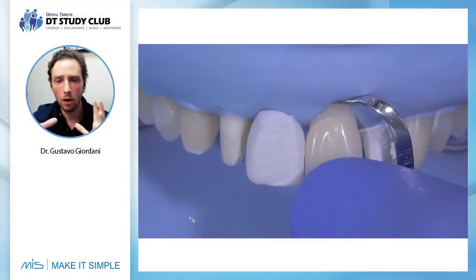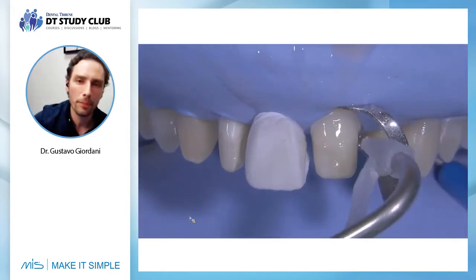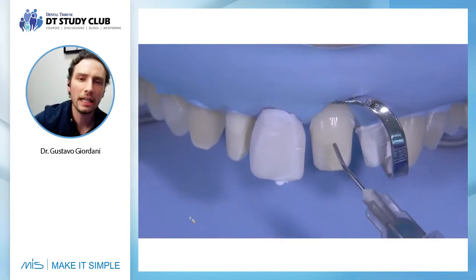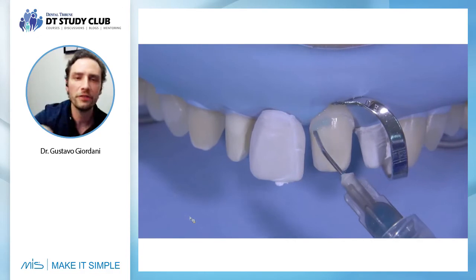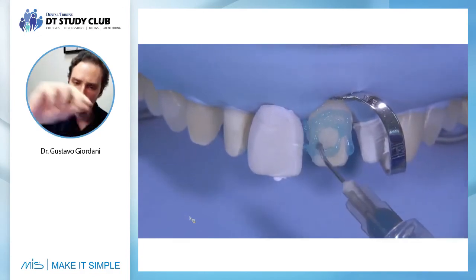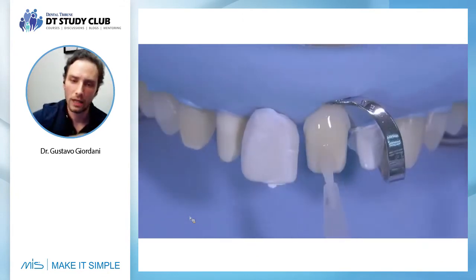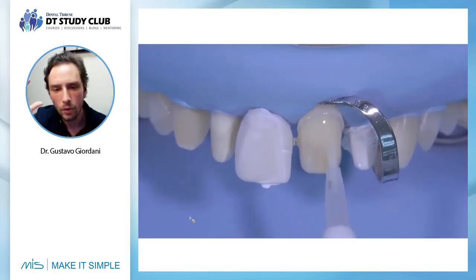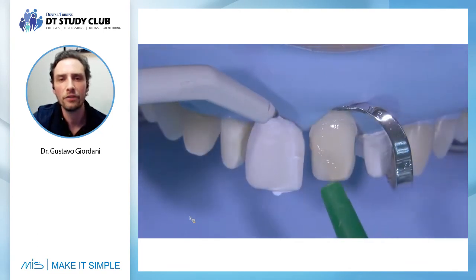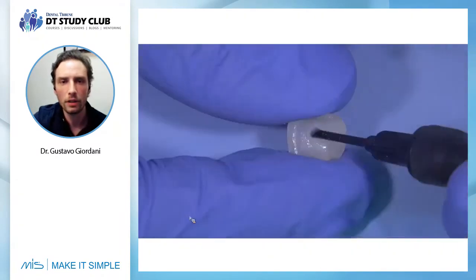So now, using the rubber dam, using the isolation, we clean the prep by using AquaCare. After cleaning the prep, we use 15 seconds of etching, phosphoric acid. We etch for 15 seconds. We clean very well. After that, we use the bond. And by using the rubber dam, it's very easy to clean very well. It's very easy to be safe in your bonding process.